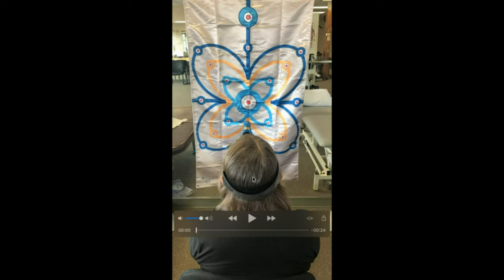So the setup here, let's go over this first. She's 5 feet away from the target. That's how I standardize everything in clinic now, because our Motion Guidance flag is set up for joint position sense error testing at 5 feet. That was a previous live stream that we talked about, and that information can be found in our YouTube videos, Vimeo page, things like that. So she's 5 feet away.